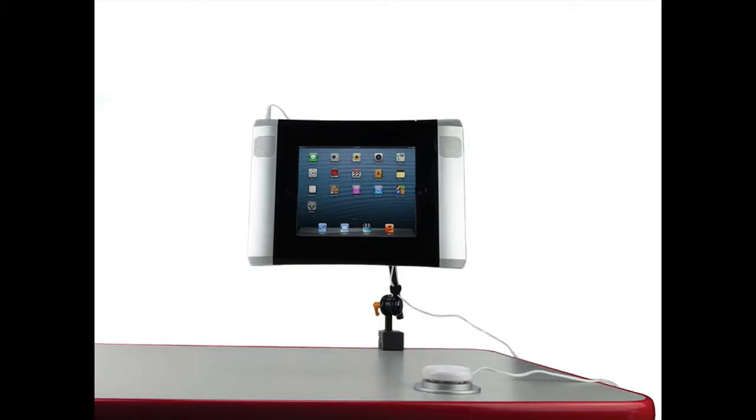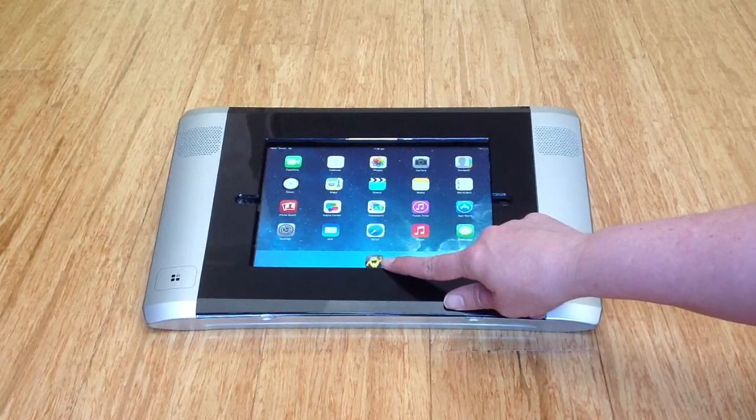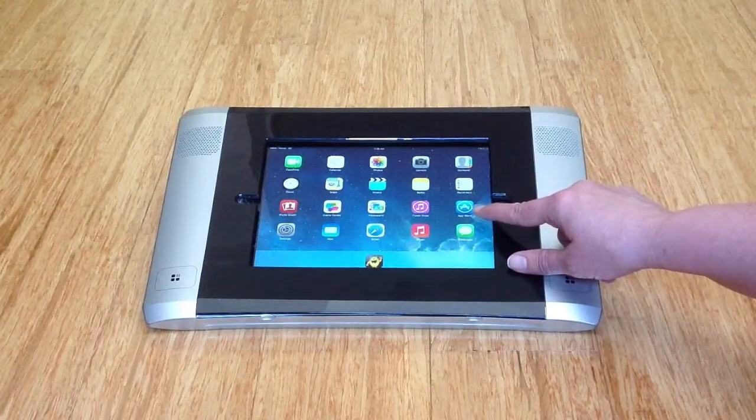And your other alternative is to plug in wired switches. So we're about to demonstrate how you can get the Connect case set up with your iPad to use switches, and I'm going to show you those different options. You can use the Connect with switch apps that are switch accessible on the iPad, or you could use the switches with the switch control settings of the iPad itself.